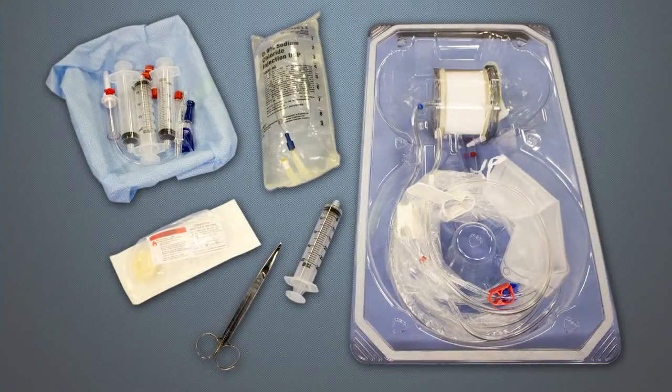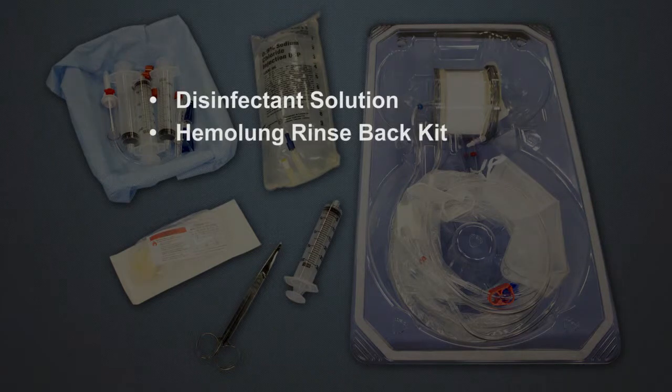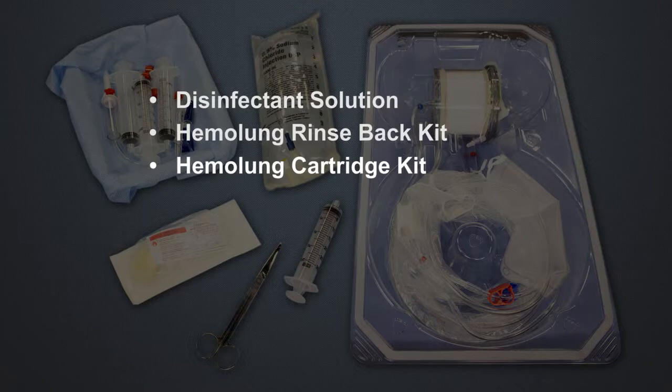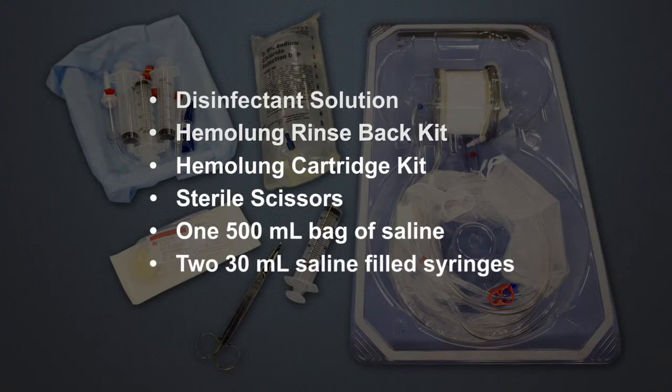Prior to changing the Hemolung cartridge, collect the following supplies: disinfectant solution, Hemolung rinse back kit, Hemolung cartridge kit, sterile scissors, one 500 milliliter bag of saline, and two 30 milliliter saline filled syringes.